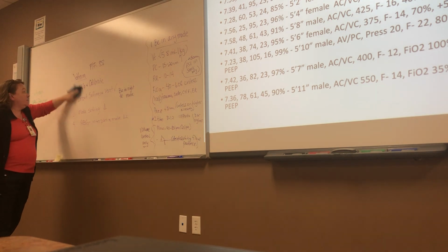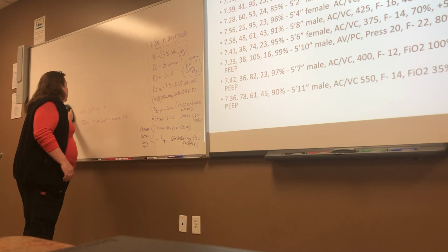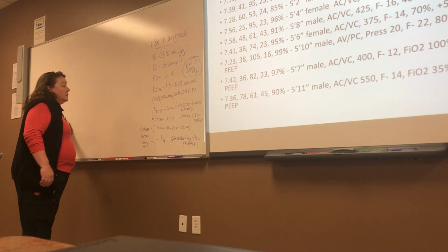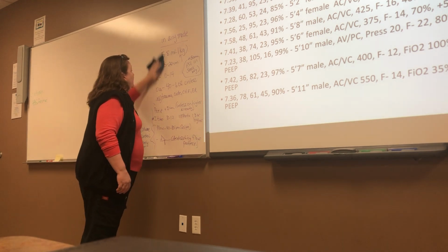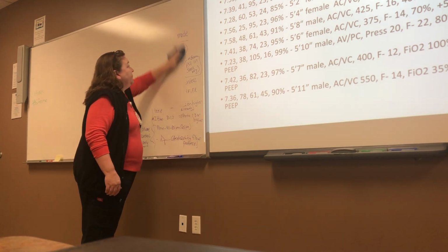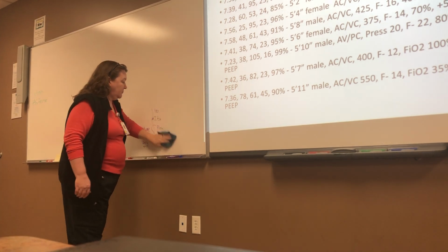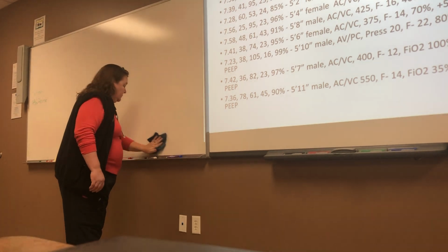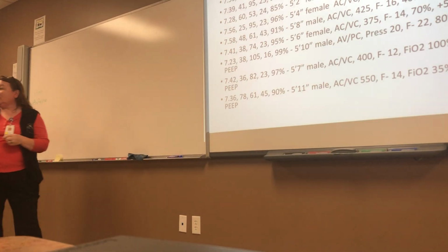So basically on flow, if it's volume, I want to, if it has the option, put it for decelerating flow, and if it doesn't, just stick with the square. Yep. And in pressure control, it is decelerating, right? Correct. Awesome. Thank you. Okay, let's review this ABG madness to make sure we're all on the same page.